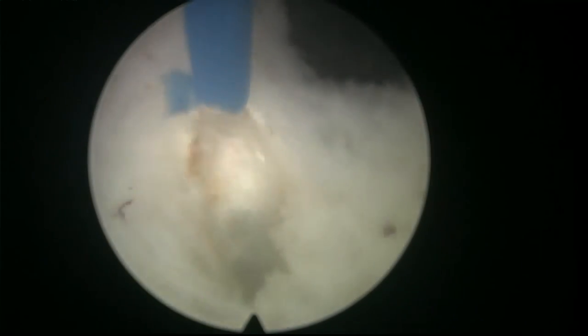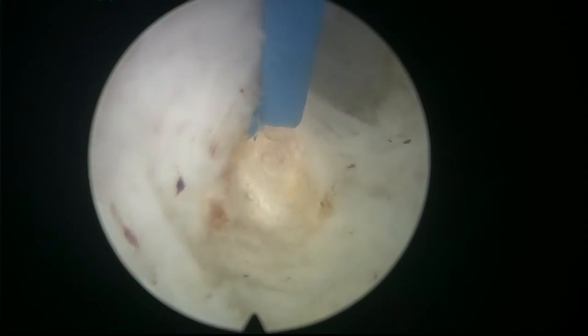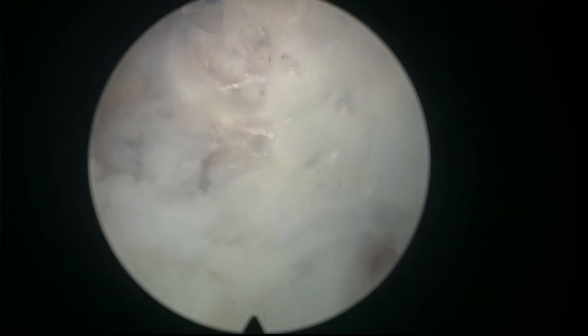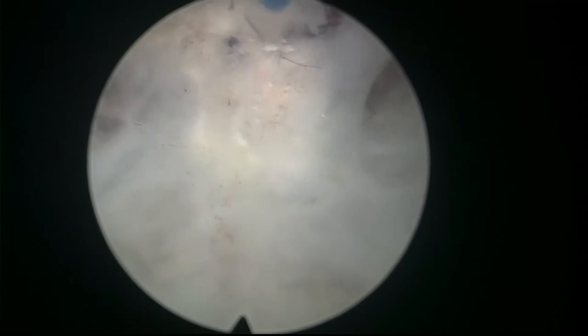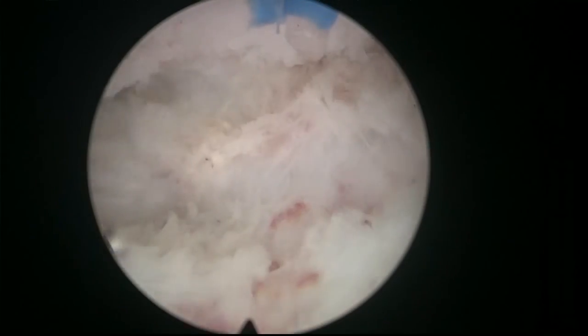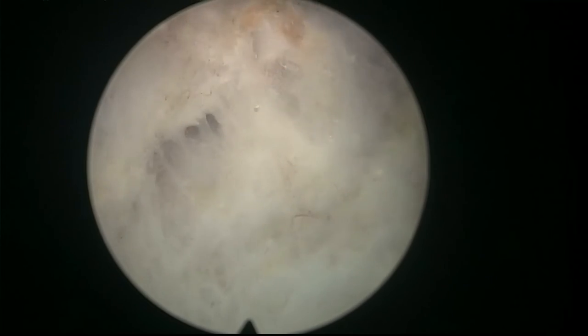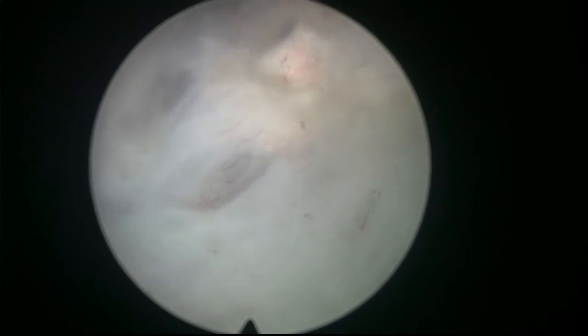When you open the bladder, if there is bleeding the blood will enter the bladder and it may be difficult to maintain visibility. Especially at the beginning, before opening the bladder neck, when you find these fibers try to do good hemostasis of the fossa, then move on. That's the bladder neck — we're cutting it down. I had already seen that the ureteral orifices were quite far, but I'm checking again. The capsule has a white appearance, and if you find adenomatous sub-cervical nodules they'll look a little more yellow.